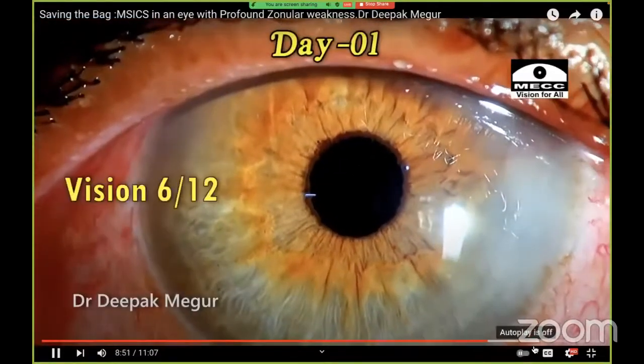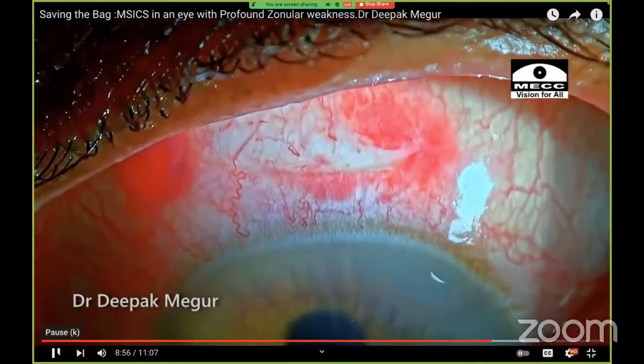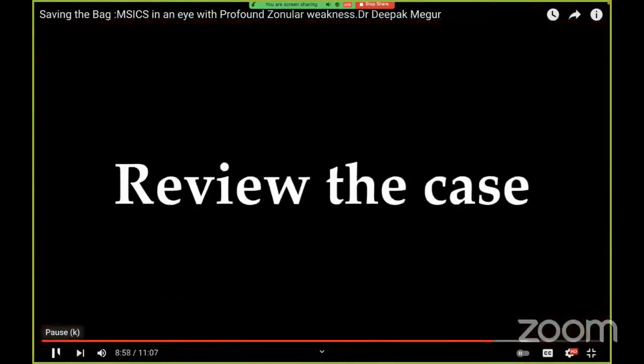These are the pictures from the first post-op day. The cornea is fine, very minimal inflammation. This is the incision site. The patient had good vision. That was it — thank you for the opportunity.